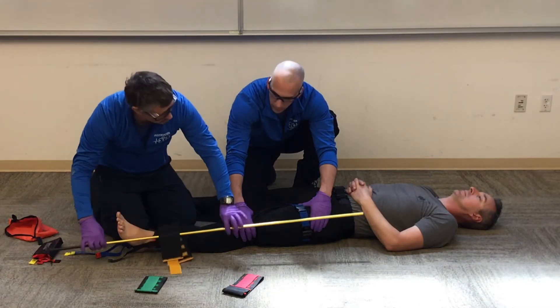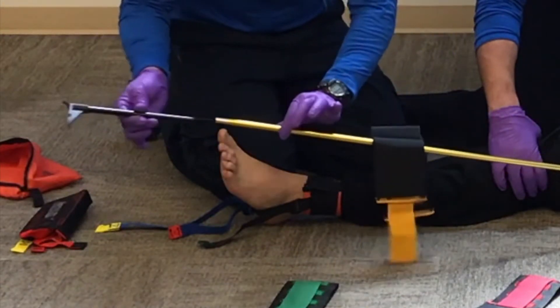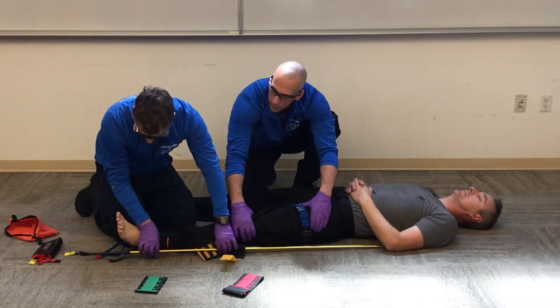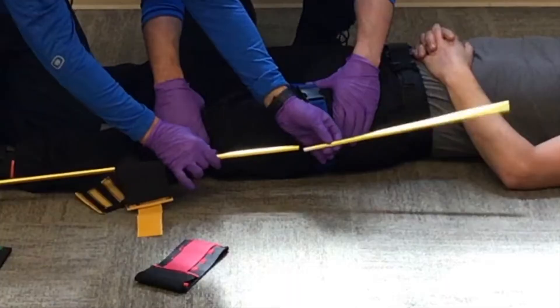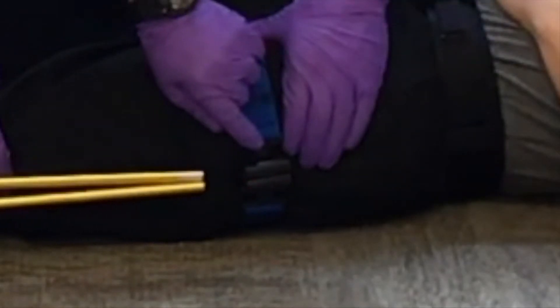Now I'm going to measure my device — I want at least one section below the bottom of the foot. I'll take out the top section, bend it in half, and that's going to go into my ischial strap.